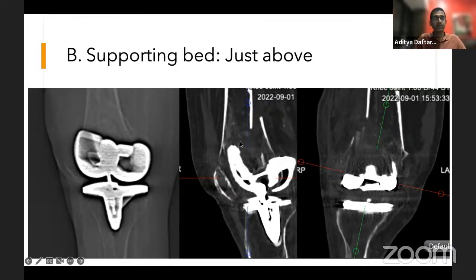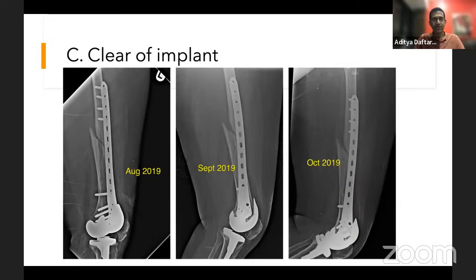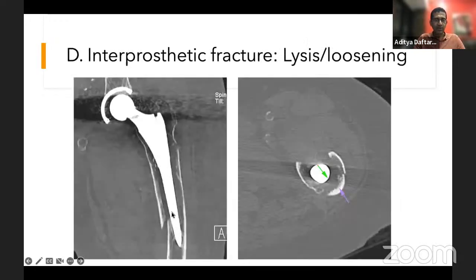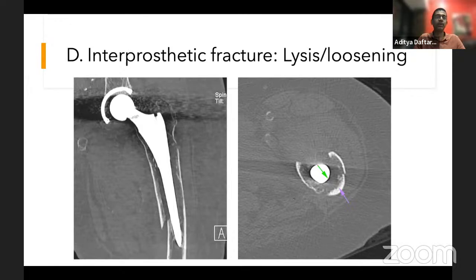Here's a patient with a fracture remote from the prosthesis site — managed the same way as any fracture in that location. Here's a fracture going through the prosthesis — an inter-prosthetic fracture. When you look at the bone, there's scalloping indicating underlying osteolysis, which is probably why it got loose and ultimately fractured. When you see fractures through a prosthesis, you want to know the status of the underlying bone — CT is particularly helpful here.